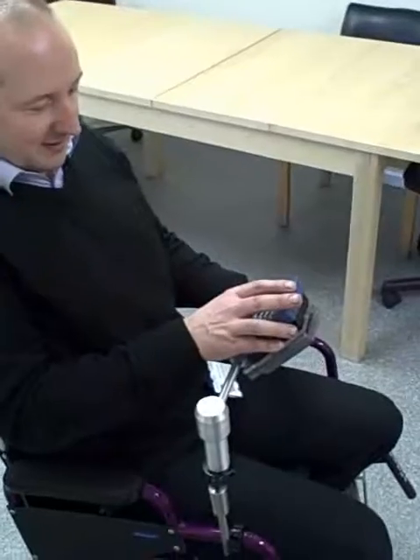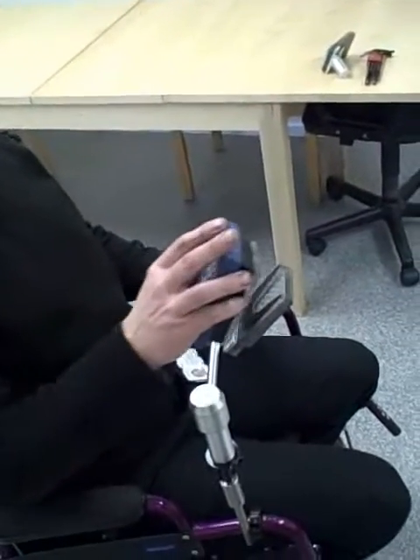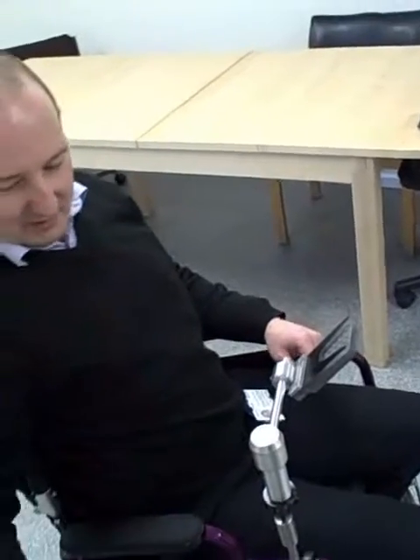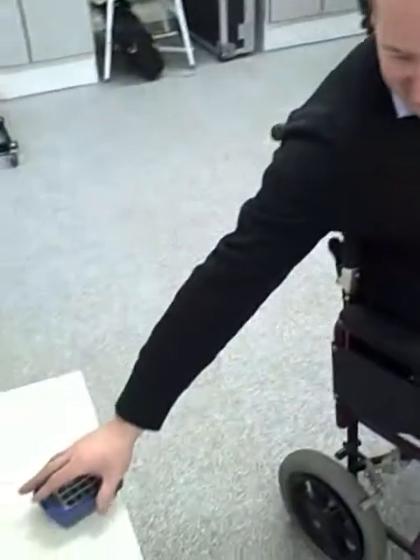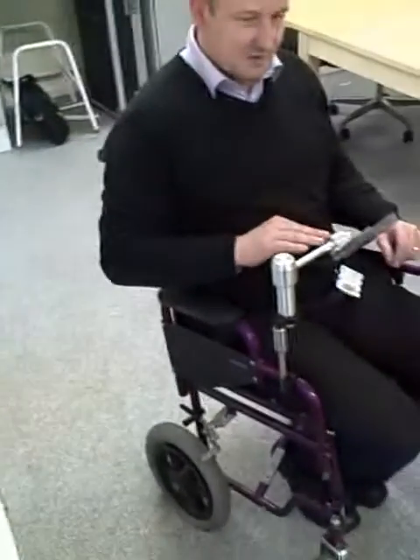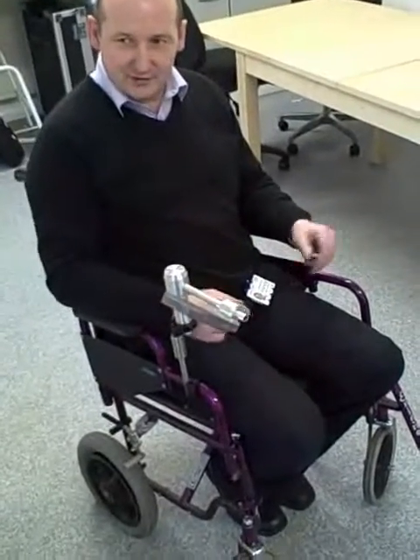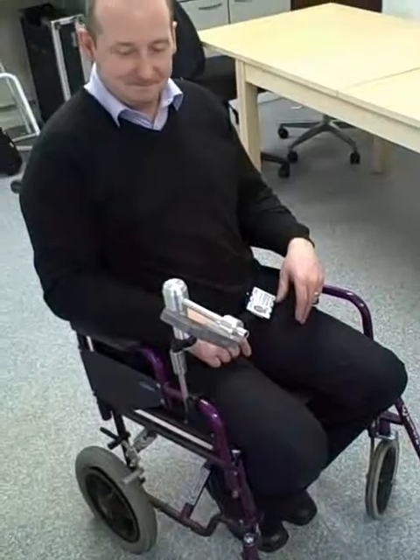He grabs the device, gives it a slight twist, and it comes off. Then he can pop it down somewhere and self-transfer from the chair. So he can open that and just sort of transfer himself.